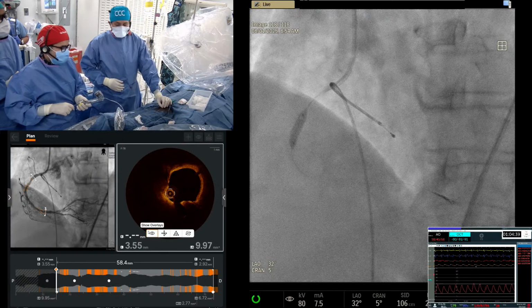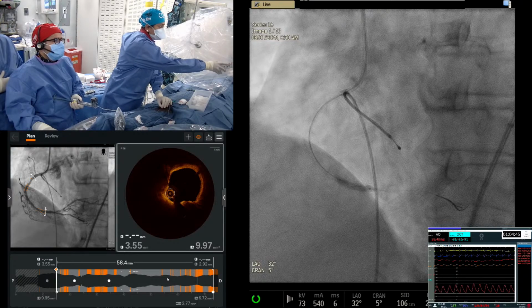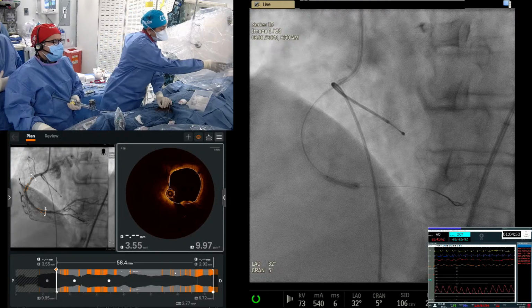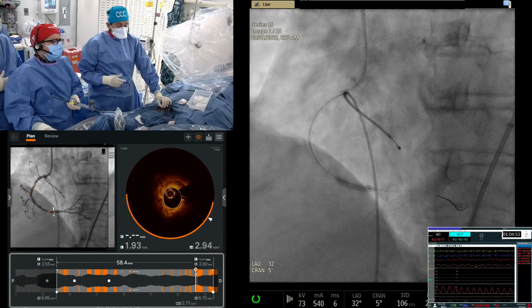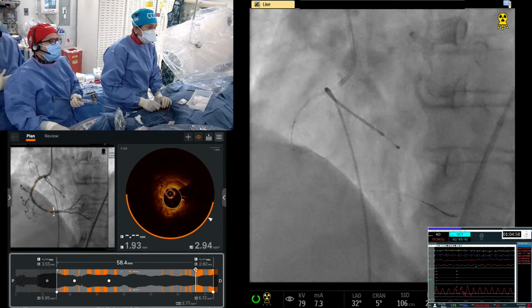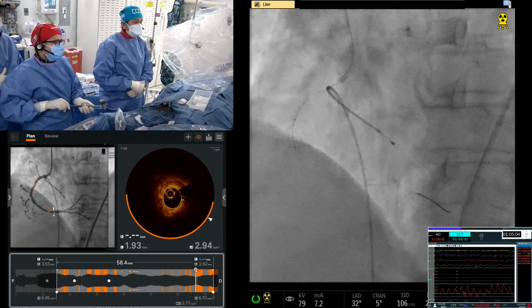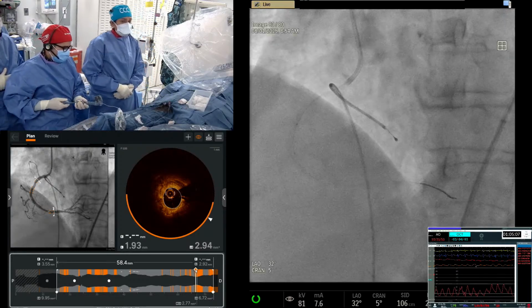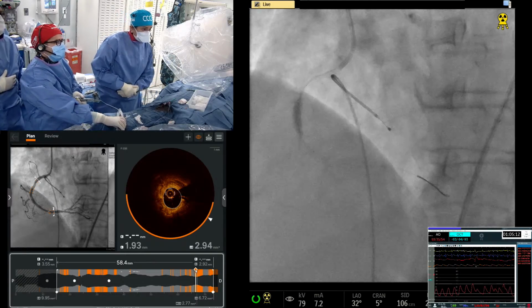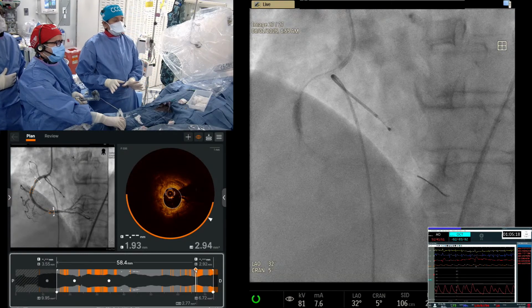So what the recommendation is, let me give you one thing. You see this is how it is. You see a dog bone, right? And when you see the vessel is fully expanded, you don't need more. There's truly no study so far to show that we have to give the 120 pulses to the entire vessel, because they say you can still give it. It does not do anything to the so-called normal looking vessel. But ideally, if the dog boning goes and you've taken care of that calcium at that level, you're done and you can take it out.